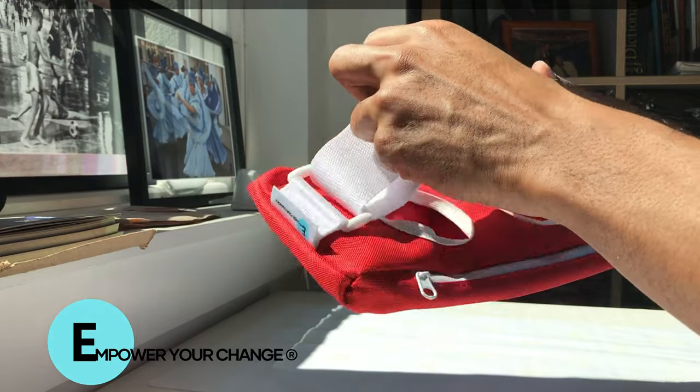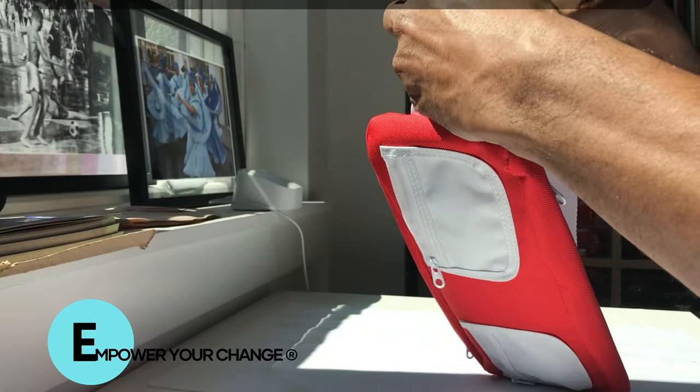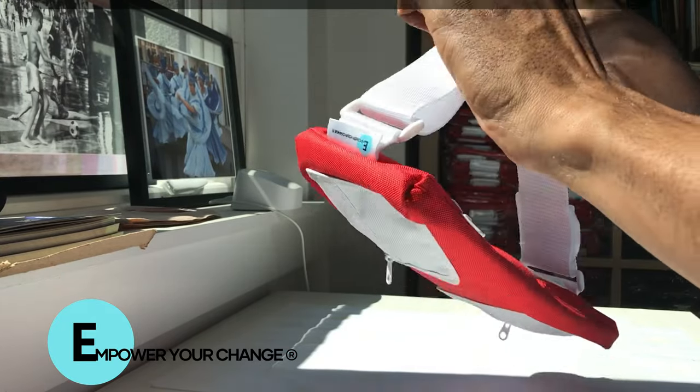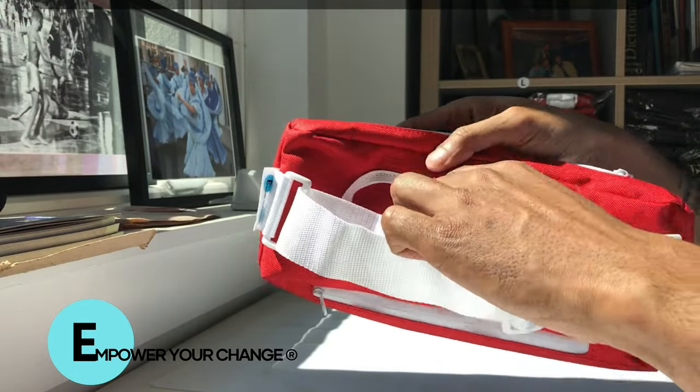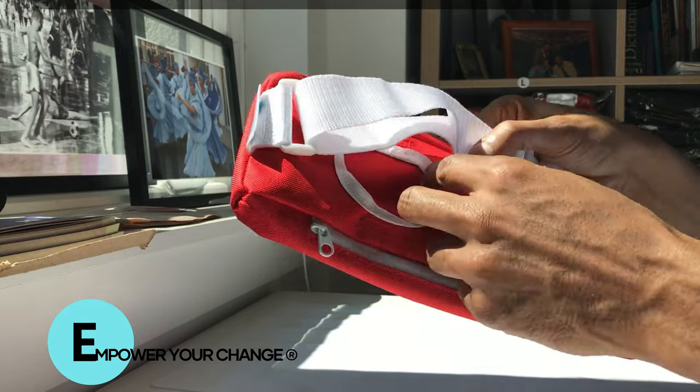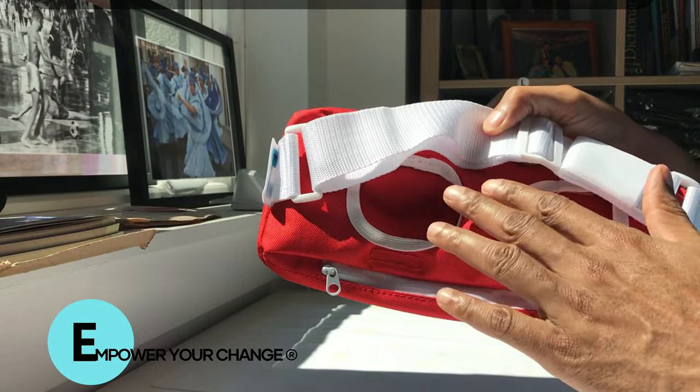The belt is also adjustable to accommodate different measurements around the belly. We also feature two pockets so that you, as an individual, depending on what size ostomy bag you have or where your ostomy is located, can wear it accordingly.